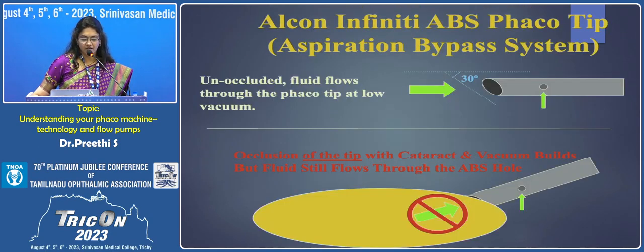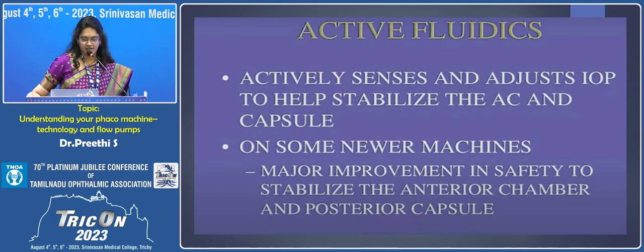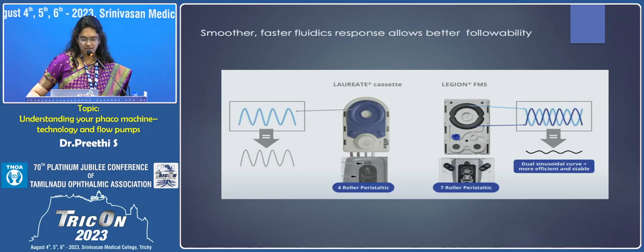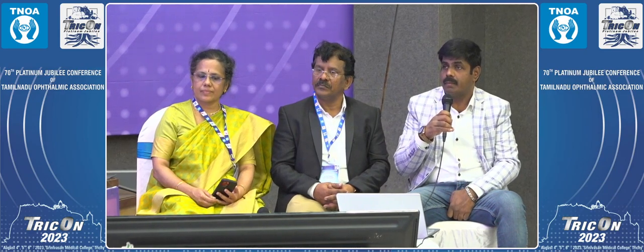And this is ABS, the aspiration bypass system, which is currently present. And we have active fluidics in the recent machines now, which do not depend upon gravity fluidics. And then these are the newer cassettes which help us prevent the extra surge. So thank you very much for the opportunity and time.